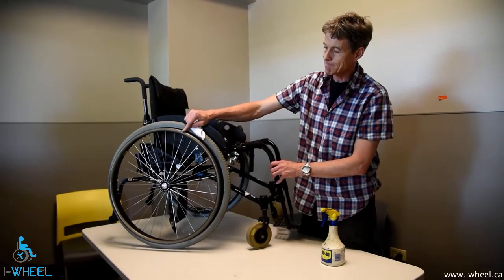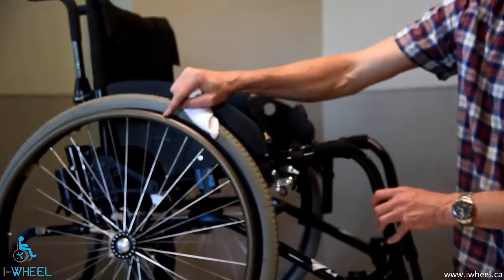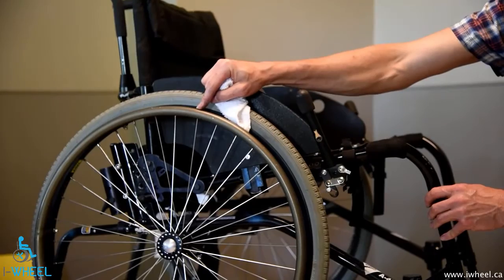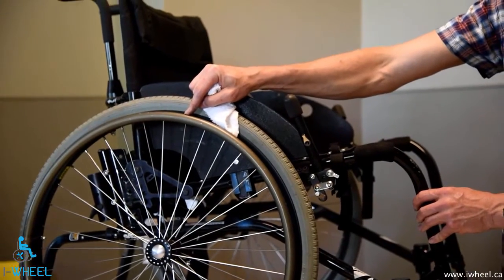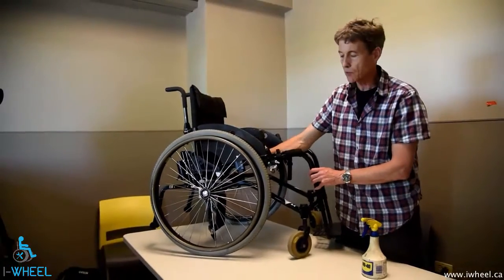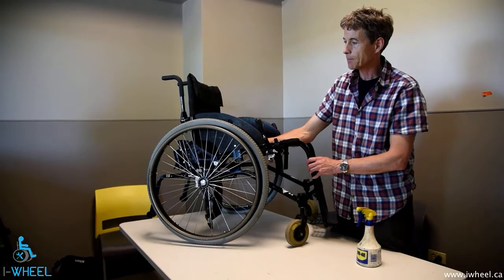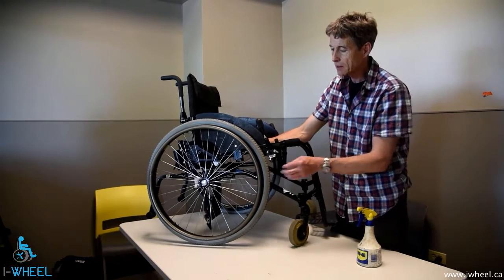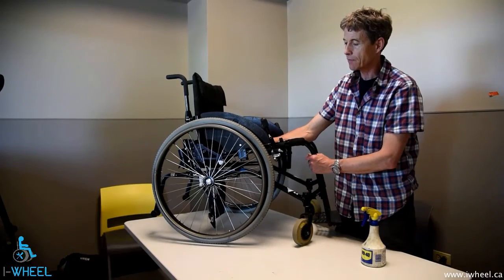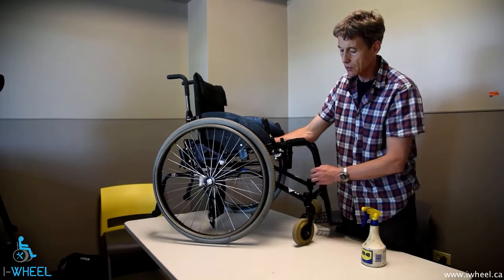For the push rims, it's nice to keep them fairly grippy, so I like to wipe them down with a rubbing alcohol — get it on the cloth, rub around. It gets rid of any grease that came from your hands and returns the push rim to its original feel. For any nicks, it's worth getting some fine sandpaper and just smoothing them down so you're not going to hurt your hands.